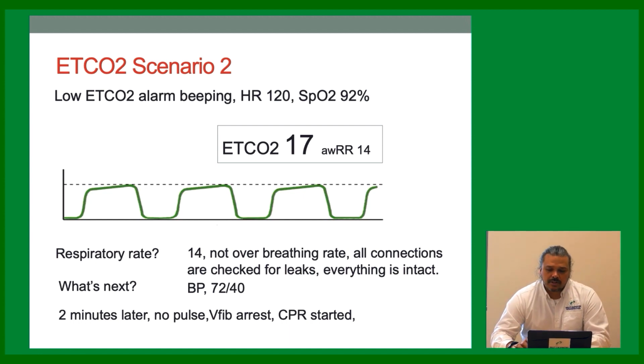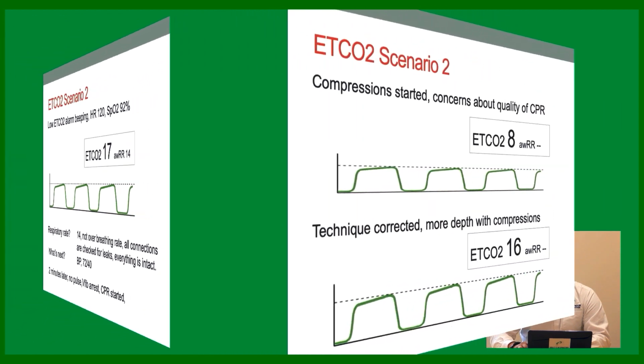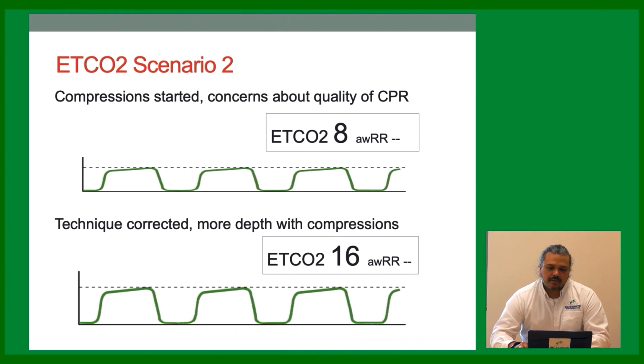Compressions started, with concerns about quality of CPR. We have an end-tidal of 8. So what do we need to do? We need to get deeper compressions, more recoil. Technique is corrected, more depth with compressions, and here we have an end-tidal of 16.